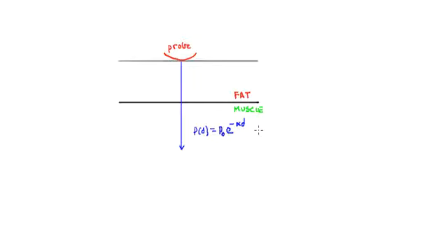And actually, alpha depends on frequency, so we usually write this alpha of f times d. And alpha of f is approximately proportional to frequency. So it goes up as frequency goes up linearly. That means that at higher frequency, alpha f is bigger, and there's more attenuation of the ultrasound beam. So that's a key concept in ultrasound. Higher frequency, more attenuation. Or alternatively, lower frequency, you can go deeper. Now, strictly, this only really applies in the far field limit, so kind of far away from the face of the probe, but it's a good concept to have.